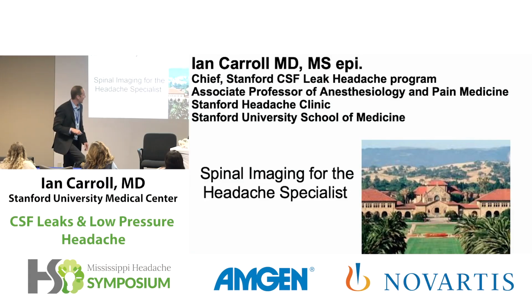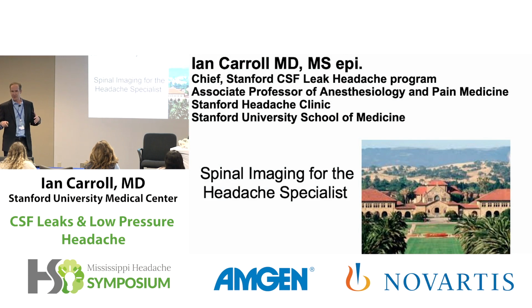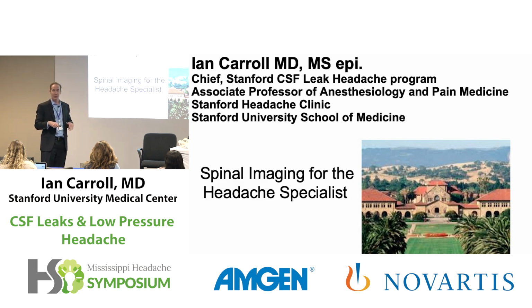I'm going to talk to you about the imaging in spinal fluid leaks. Actually, my introduction to the things that predispose to it, when you should think about it, and how to find it, is in tomorrow's talk. But keeping in the theme of radiology, I wanted to go over some of the imaging characteristics related to spinal fluid leaks for people who are headache specialists.